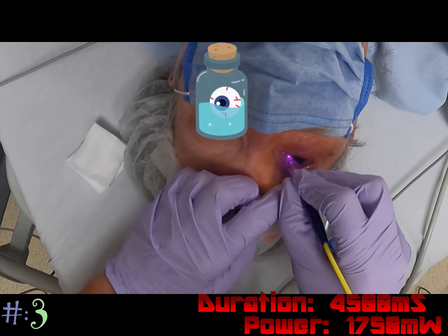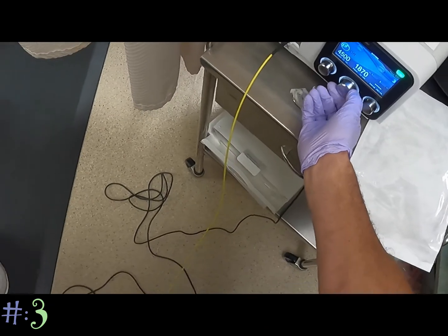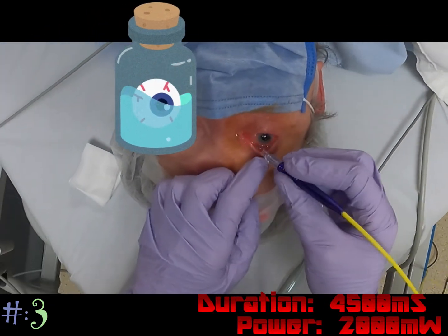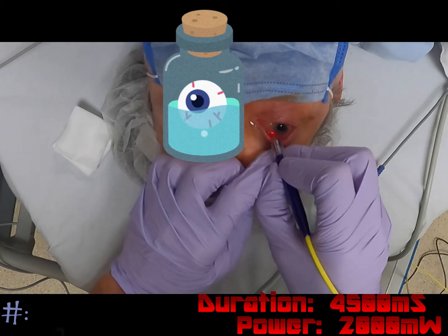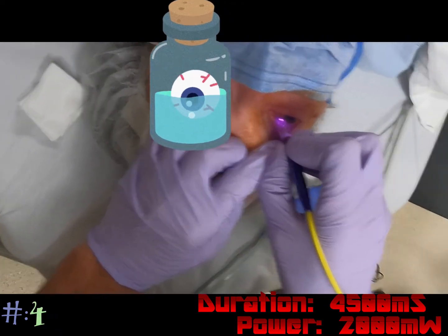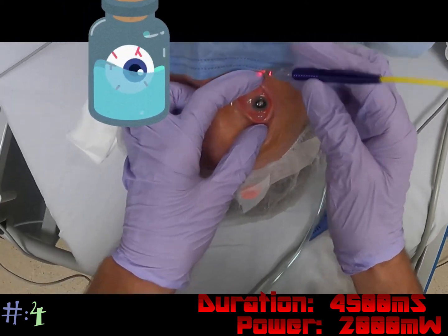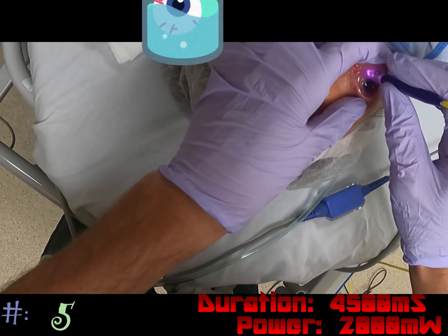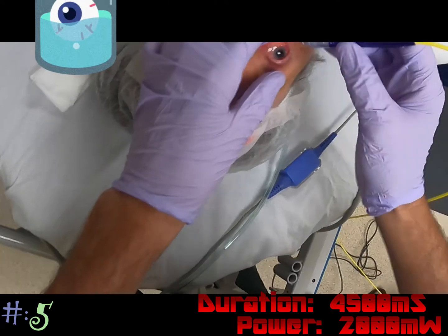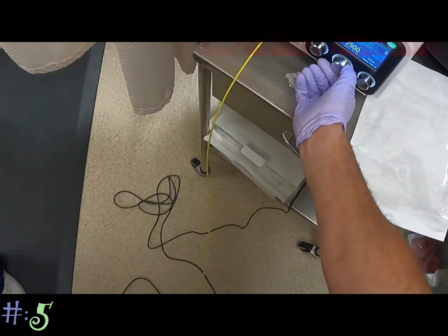Nothing there, so we're going to turn up the power to 2000 and do the same thing — adjust and go next to where we went before. The spots count, but we're looking for a crackle. I don't usually like going above a power of 25 with my settings. Nothing again, so I'm going to bring it up to my full power of 25.